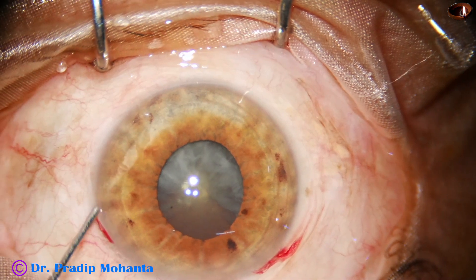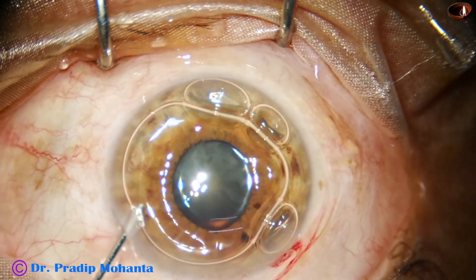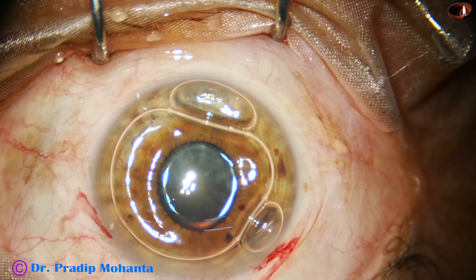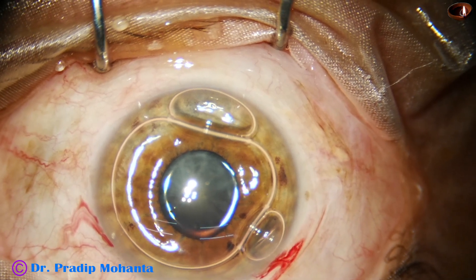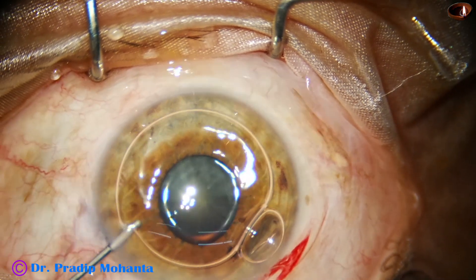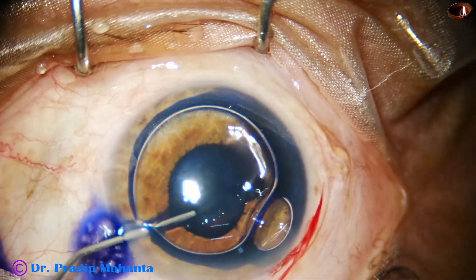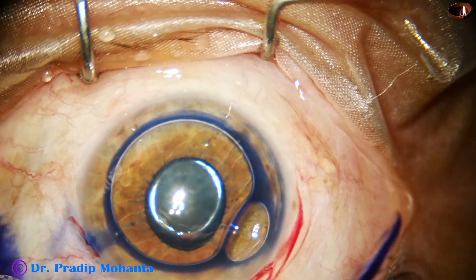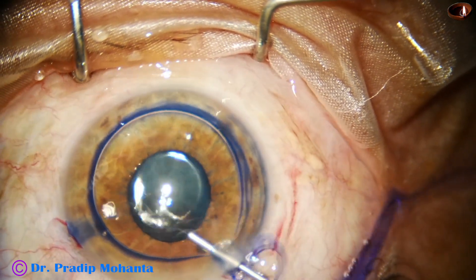An air bubble is injected to fill up the anterior chamber. Staining of the anterior capsule is faster when we use an air bubble. I always wash the excess dye out.